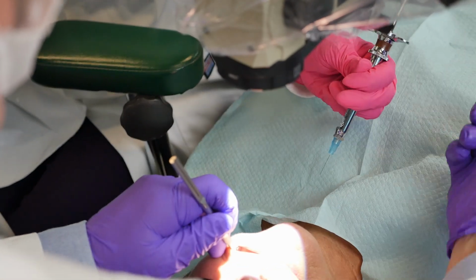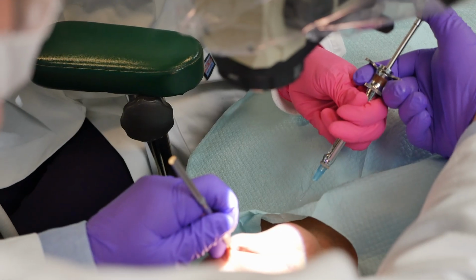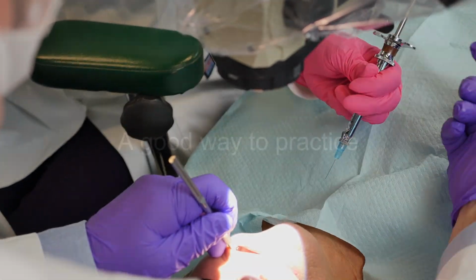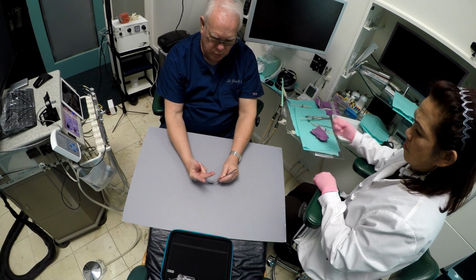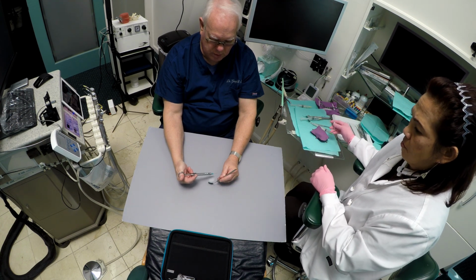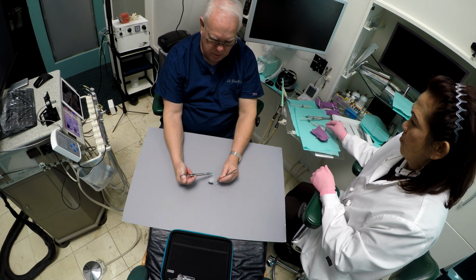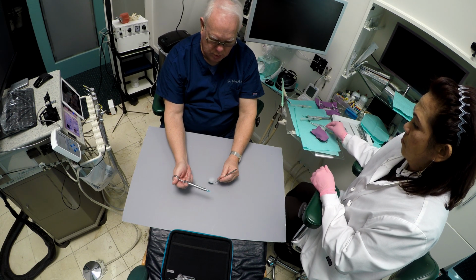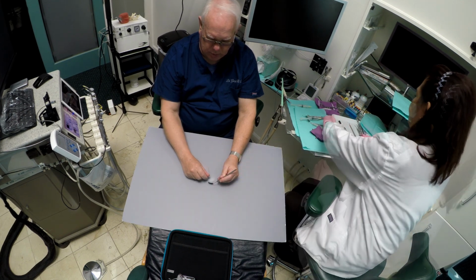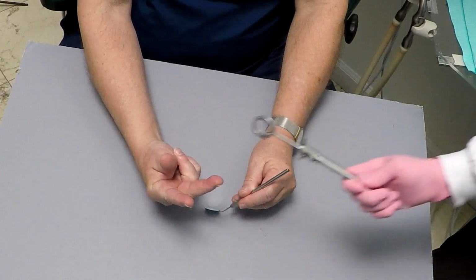Here this is in slow motion back and forth. There you can see I'm actually moving. I should be holding steady until Joy actually moves. I recommend getting a card from Aaron Brothers or something, a gray card, and then putting a camera up on the microscope and GoProing yourselves, and do this over and over again until you have it down cold. Take the video, study it together with your assistant. Use the slow motion and the magnified views.